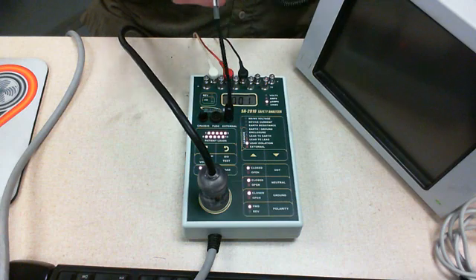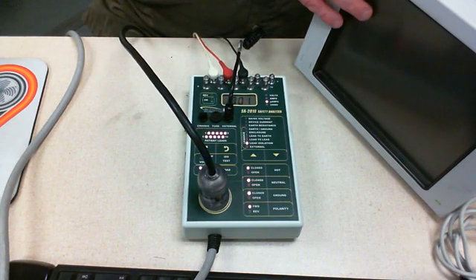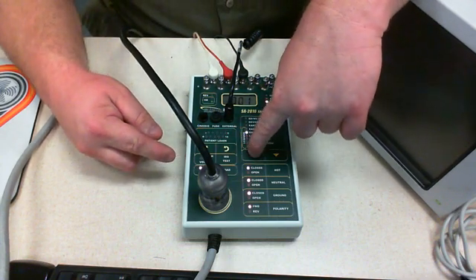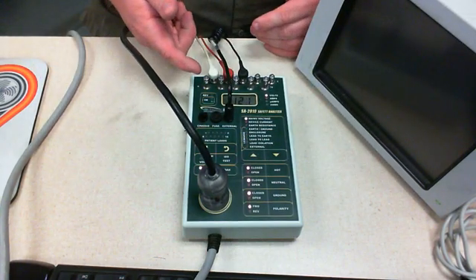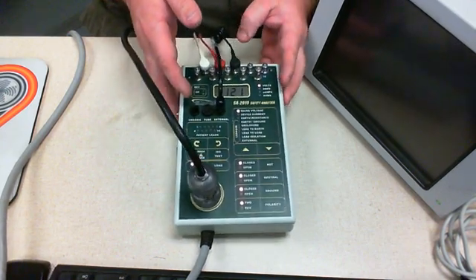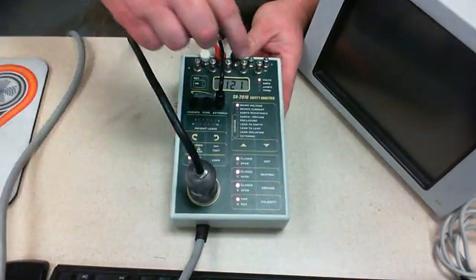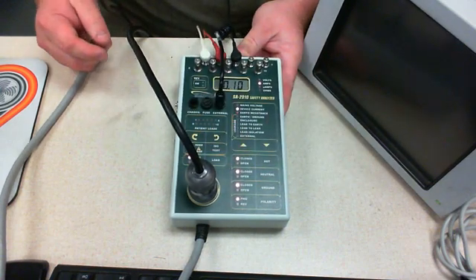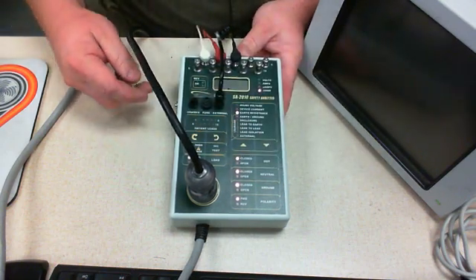I've got the Calvin cable hooked up and connected to external, plugged onto a ground plug on the back of the device. We're going to start with our electrical safety. There's the incoming line voltage — I've got it on mains voltage right up top — and I'm going to go right down all of these. There's the current the device is using: it's drawing a tenth of an amp.